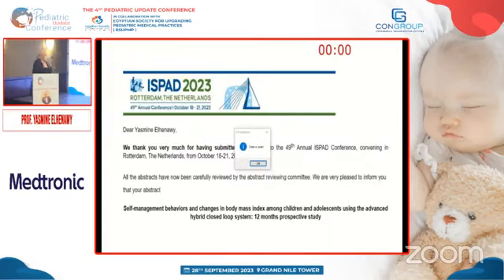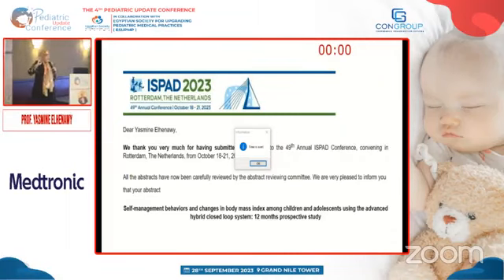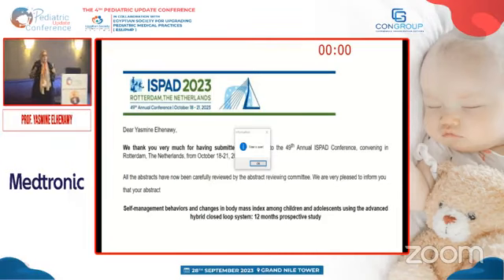We will also be presenting data on self management behavior and the effect of automated insulin delivery on the change in body mass index, weight gain, and carb intake. The preliminary data after a 12-month prospective study shows no difference in body mass index and carb intake, and at the same time patients are still engaged with the system.